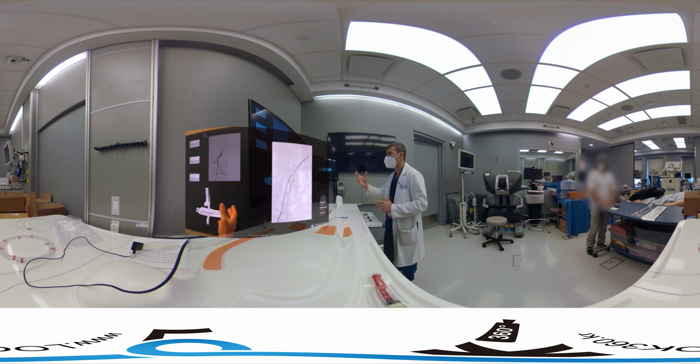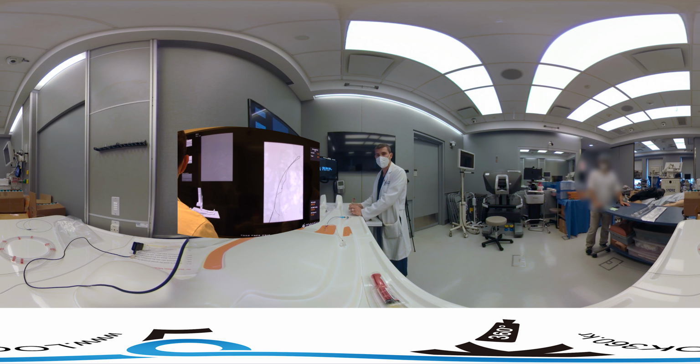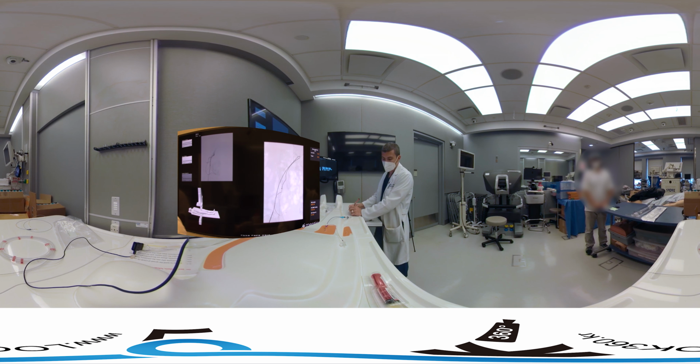All right, so now our microcatheter is in a good position, and we're going to do our embolization on this side. So for this side, again, we're going to select the microspheres. We're going to use somewhere between 500 and 700. And we're going to deliver them slowly just past the cervical vaginal branch here in the uterine artery. So here you can see I'm pulsing it in. We're getting good opacification of the uterus, the fibroid uterus. I'm not seeing any reflux just yet, so we're going to keep going.